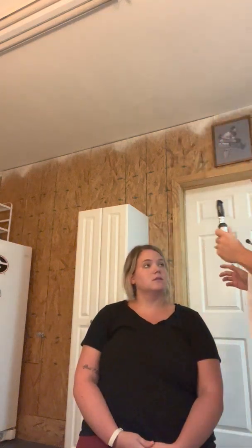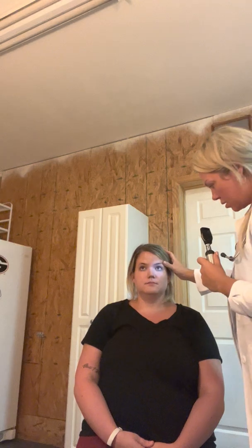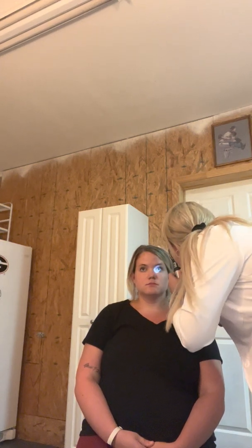And now I'm going to use my left eye to examine your left eye. I'm just going to have you look straight ahead. And I am just going to brace my head here for support. Using my left eye, I'm going to start at about a 15-degree angle. I'm going to come in. All right. I see the red reflex. The optic disc is sharp.